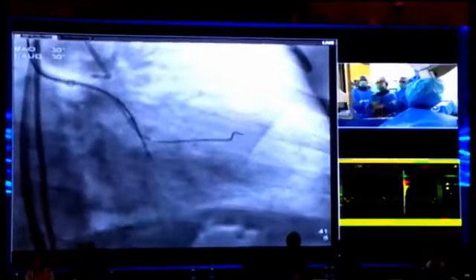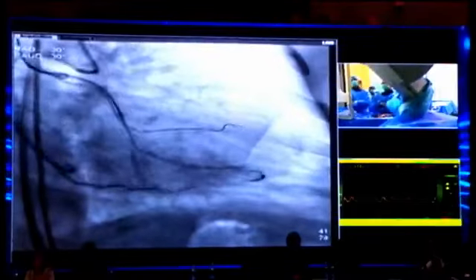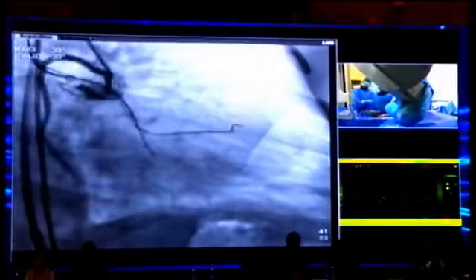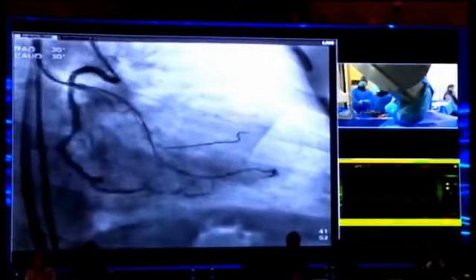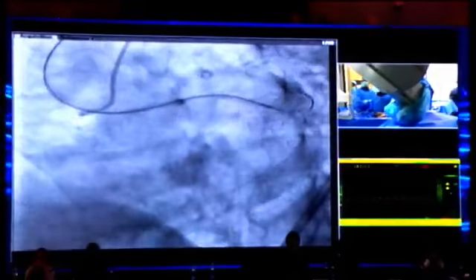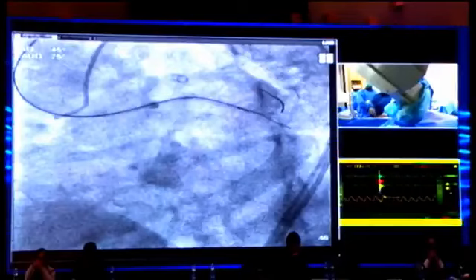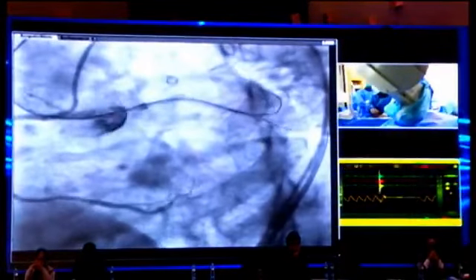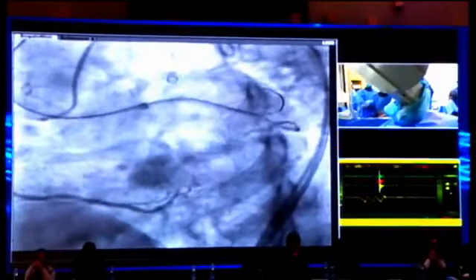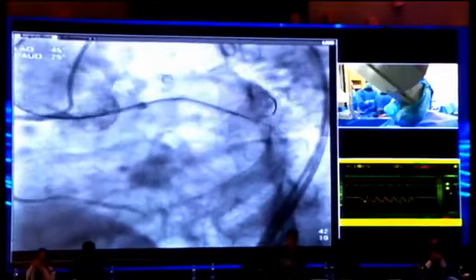My plan is I would like to advance the circumflex SR part, but at this point it's not so. From this imaging, your wire direction is okay, I think. The position is maybe not so bad. I don't know, my feeling is not so good. But looks like it gets in. This is looking okay.